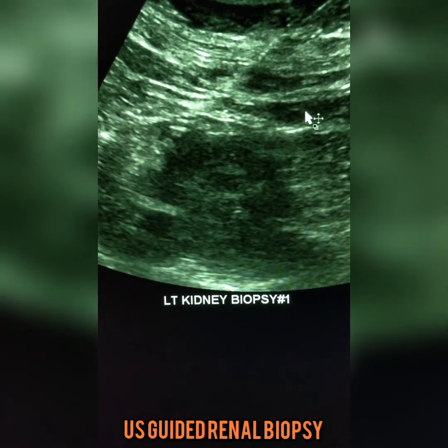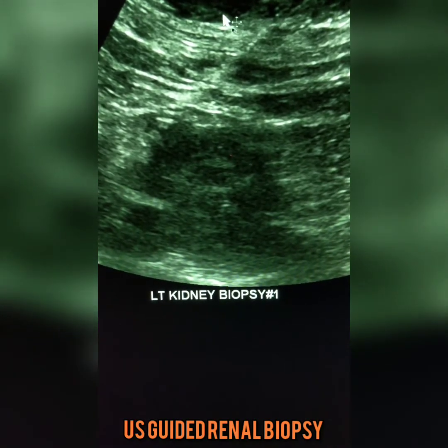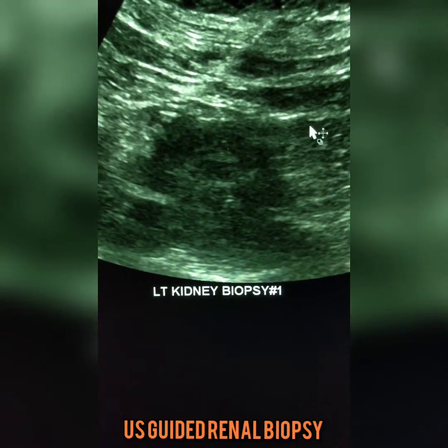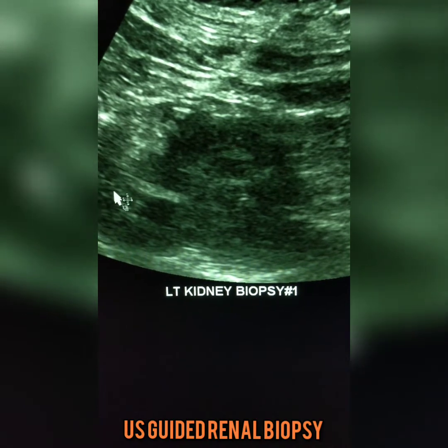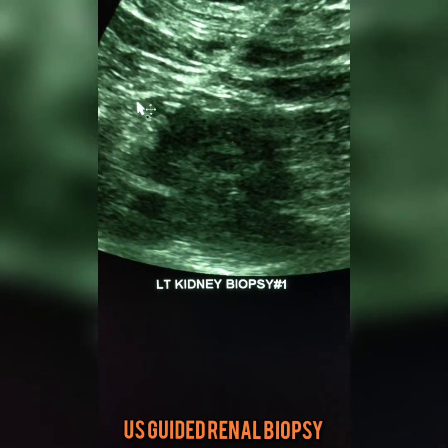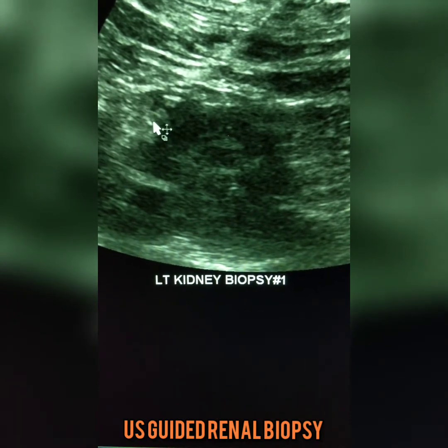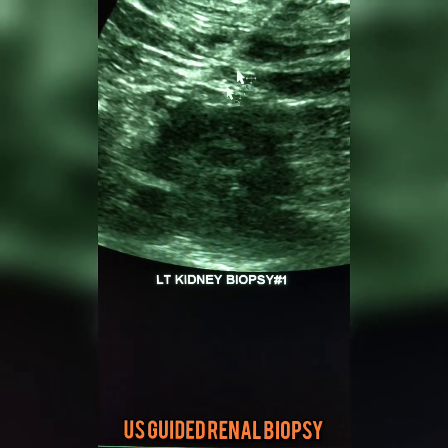Here's the ultrasound-guided biopsy I did this morning. Patient's head is up, feet are down, and the skin of the left flank just under her ribs is up here. Spleen is up here. I had the patient take a really deep breath in and got her positioned so it splayed open her left side and brought the kidney down — when you breathe in deeply, your organs move down. Here's the kidney; the black stuff is the renal cortex, the normal tissue, and this is the mass, which is a little bit brighter grey. This diagonal line is my biopsy needle going through the coaxial needle from the skin down to the mass, with the tip about there. We took three pieces of it and are sending them off to the pathology lab to find out what the pathologist thinks this is.